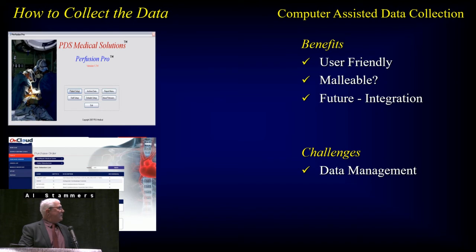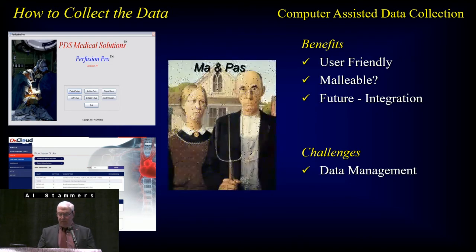These are great systems and something that's easily achievable because they're tablet-based or computer-based and can be easily mounted on the heart and lung machine. And the benefits are they're user-friendly, malleable. Challenges right now, and I know Brian's probably shaking his head behind me if he's not getting ready to throw something at me: data management is one of the issues that I know they're working on, and that means what do you do when you have this large amount of data? The other systems have sophisticated transfer mechanisms. These do too, but it's just something that I think is for future development. And I'd love Brian to talk about that at the end.